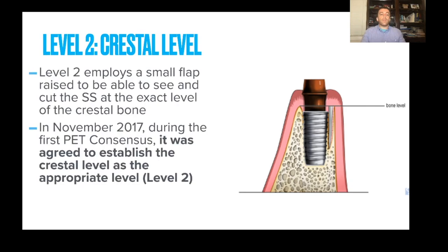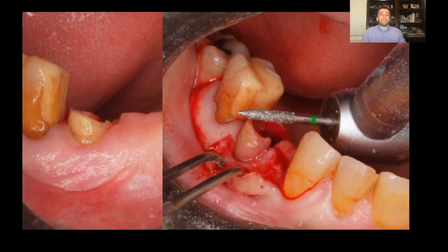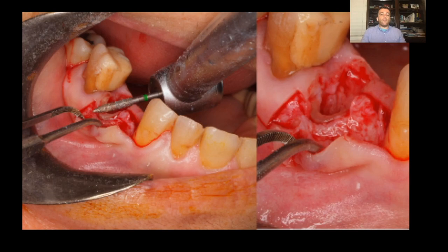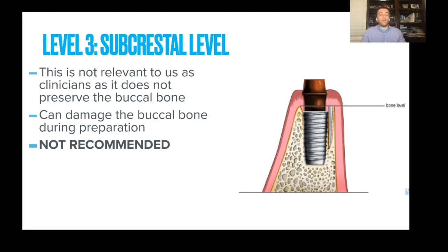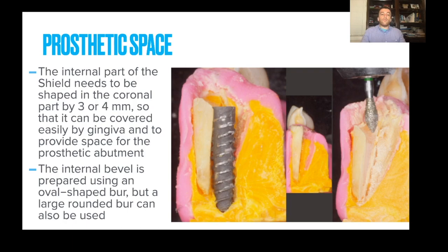The mini flap technique, as described by Dr. Maurice Salama, is implemented. Using a small flap, you visualize the socket shield to level it exactly at the crest of bone — this results in fewer shield exposures. You raise a mini flap, ensuring the shield is level to the crest, to avoid any chances of shield exposure. As for the subcrestal level, this is not recommended because you can damage the buccal bone by having the shield prepared below the buccal bone level.